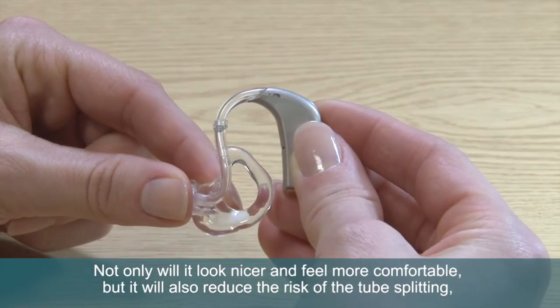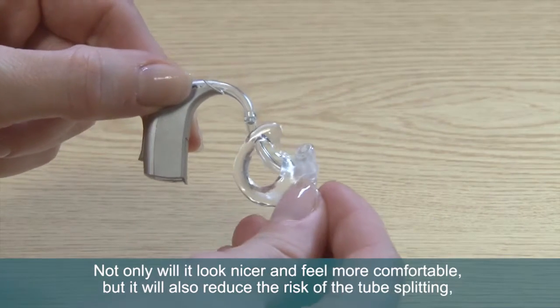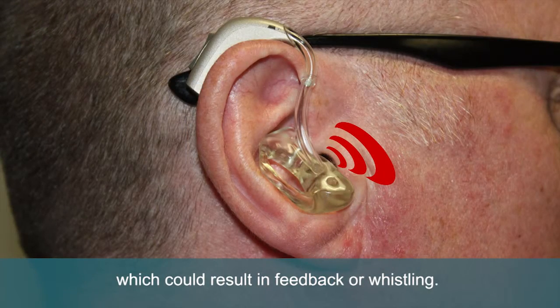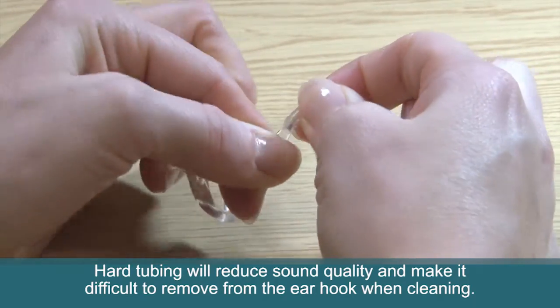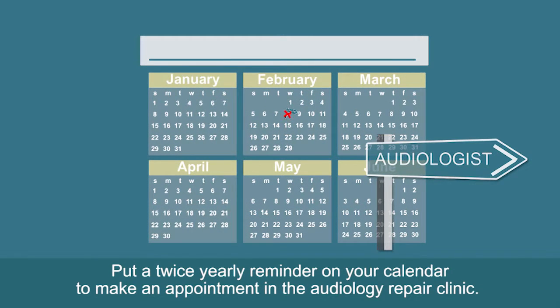Not only will it look nicer and feel more comfortable, but it will also reduce the risk of the tube splitting, which could result in feedback or whistling. Hard tubing will reduce sound quality and make it difficult to remove from the ear hook when cleaning. Put a twice-yearly reminder on your calendar to make an appointment in the audiology repair clinic.